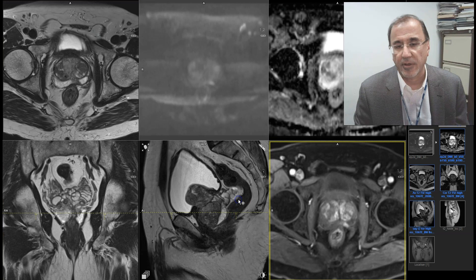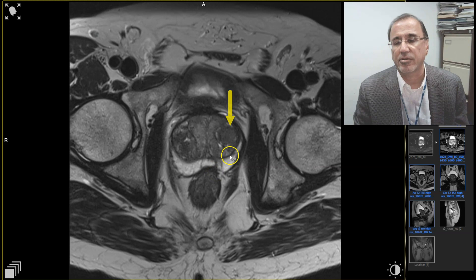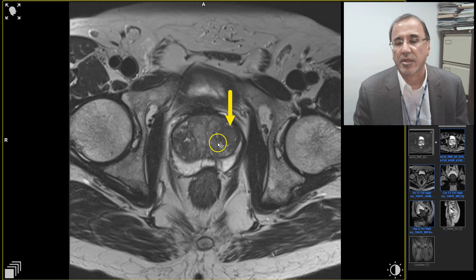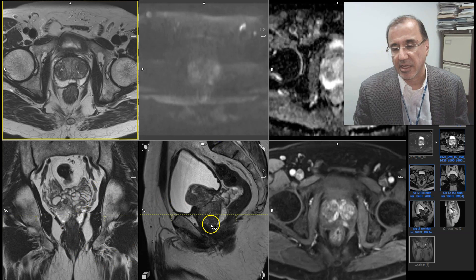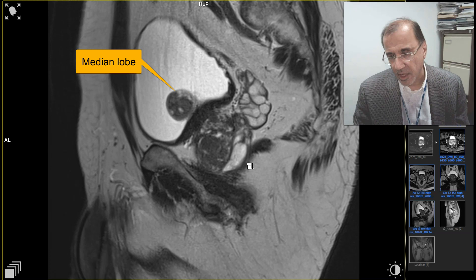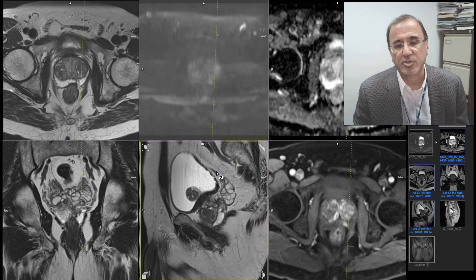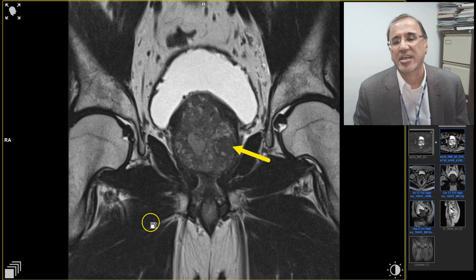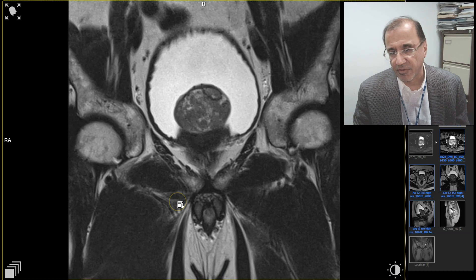We also need to look at the transition zone. There is a nodule with glandular structures around it. In another plane, we see such a large nodule of BPH and a median lobe. There is a stromal nodule with glands around it — that looks like a stromal nodule. In the coronal plane, again there's the stromal nodule with glands around it and this very large median lobe sticking into the bladder.